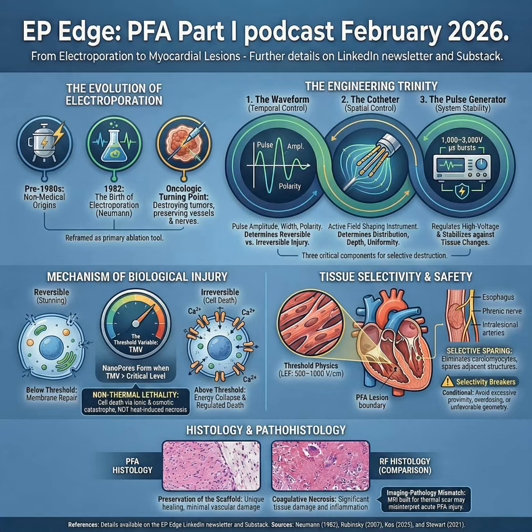And in some models, vessels and nerves were less injured than with thermal ablation. That concept is a big deal because it tells you the injury is not burn and scar in the classic RF way. It's a different biological injury with different healing behavior. Once that was established, the jump to cardiology was almost inevitable.